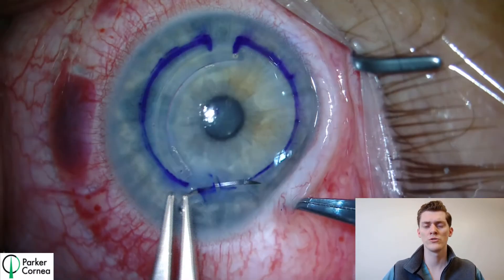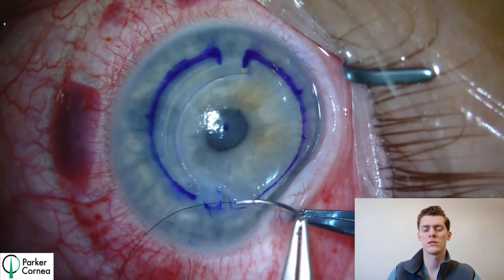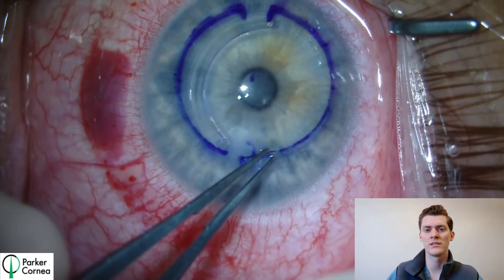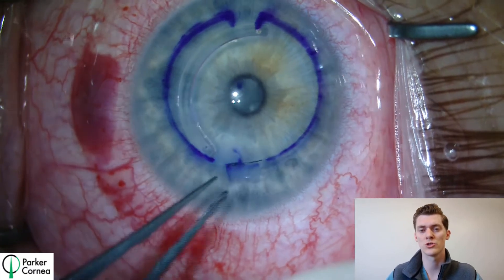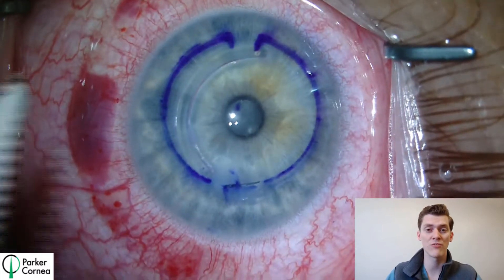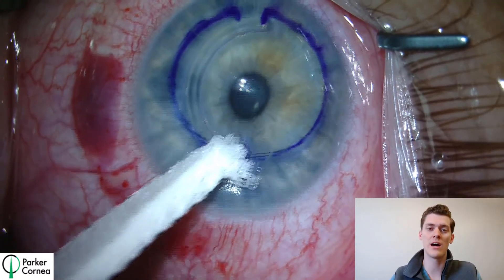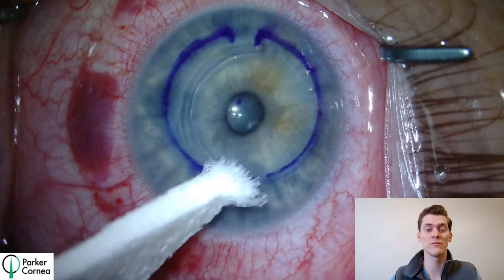Also, we used a suture in this case because we wanted to make sure that the wound was indeed closed. After burying the knot, we used a Seidel test to ensure that the wound was not leaking. Once successful, we concluded the operation and the patient followed up again the next day. At that point, the patient was thrilled with the outcome and had an uncorrected visual acuity of 20/25.